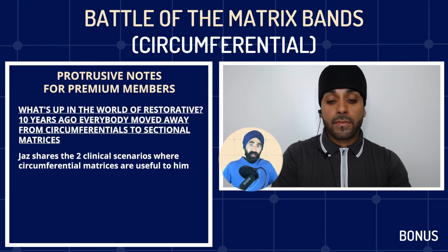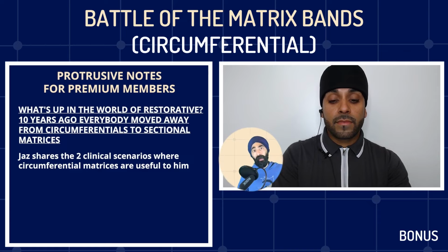But then over the years, I found the greater curve system, which we're going to talk about. This is brilliant for those really large ones that perhaps in some other cases I might do a crown, but for whatever reason, we're doing a large reconstruction. There, that word again. And I found this system really helps me to get the contacts. So that's the direction we're going in.